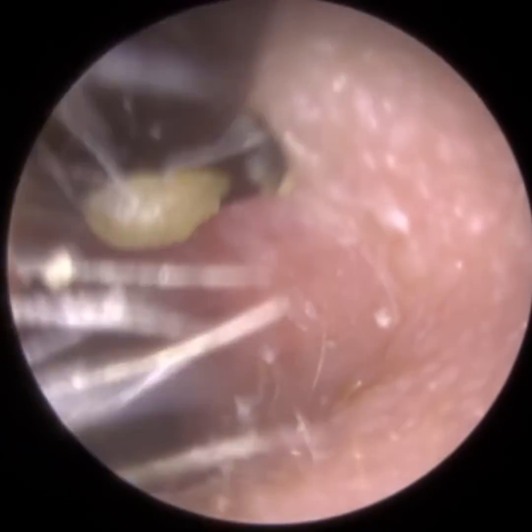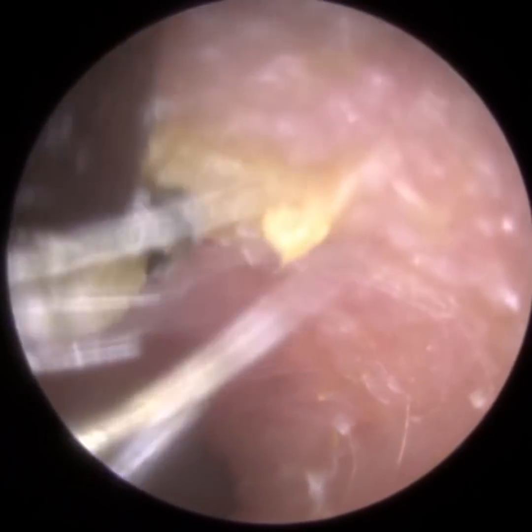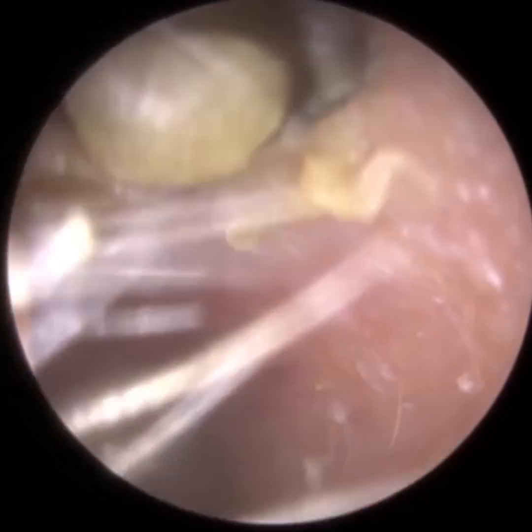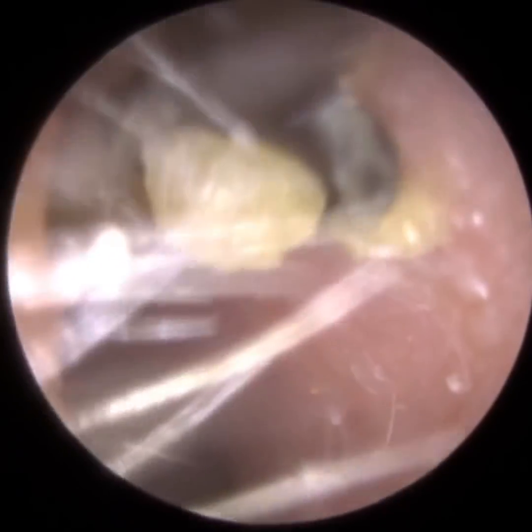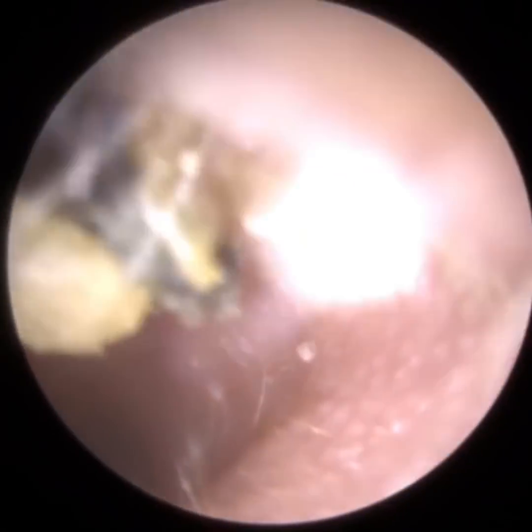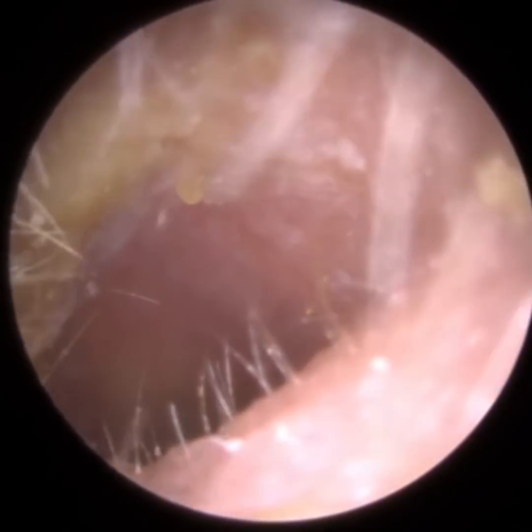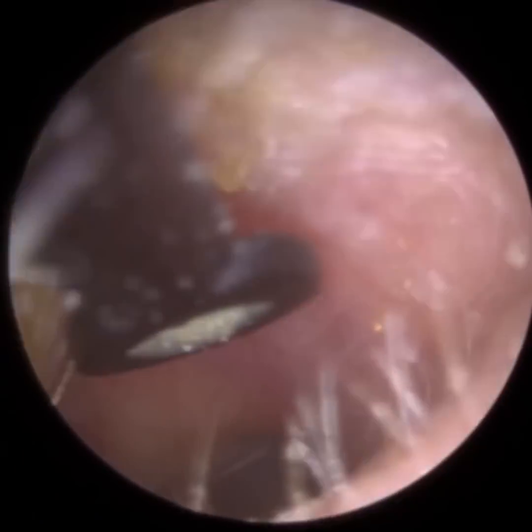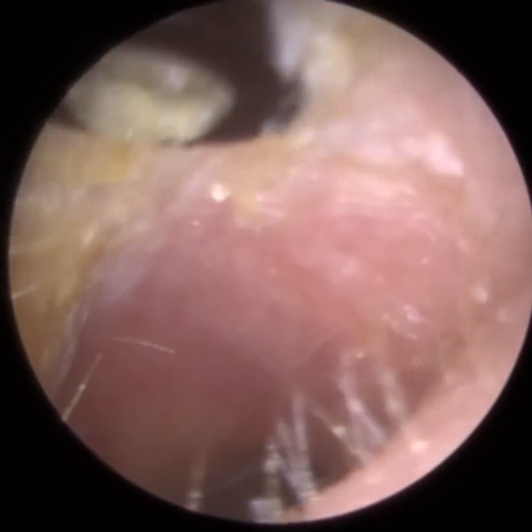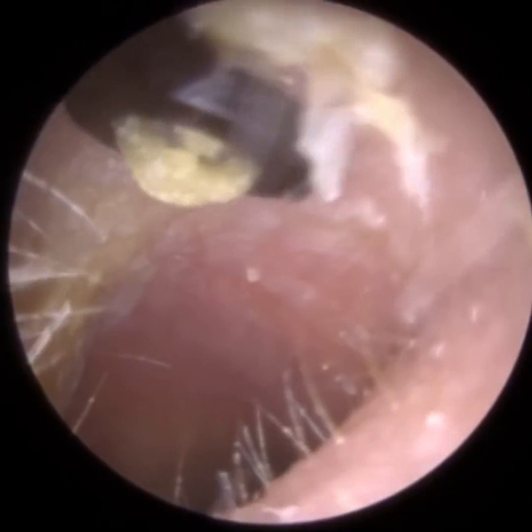Now, incidentally, you'll see in a moment the patient's left eardrum, and the bottom left corner of the eardrum is slightly bulged. I know there's not any fluid behind the eardrum, so you can sometimes develop glue ear, and glue ear can cause a bulging of the eardrum, because I did a pressure test to ascertain whether there is fluid behind the eardrum. We call it tympanometry. We play a sound in the ear, we change the air pressure, and we just measure the movement of the eardrum and how much sound is absorbed into the ear via the eardrum and the three little bones. It's a test called tympanometry. It takes all but 2 or 3 seconds to perform.